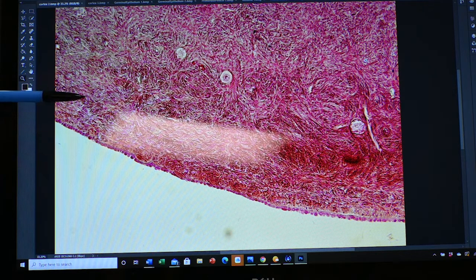This is the very outside of the ovary along here, and it has the simple cuboidal germinal epithelium in there. And once you get inside of that, there's not a very distinct layer of more dense material right here on the edge. Really doesn't look all that different from the deeper material of the cortex. But sometimes you can tell that more dense layer on the outside, that tunica albuginea layer, but it really doesn't show up here in this view.